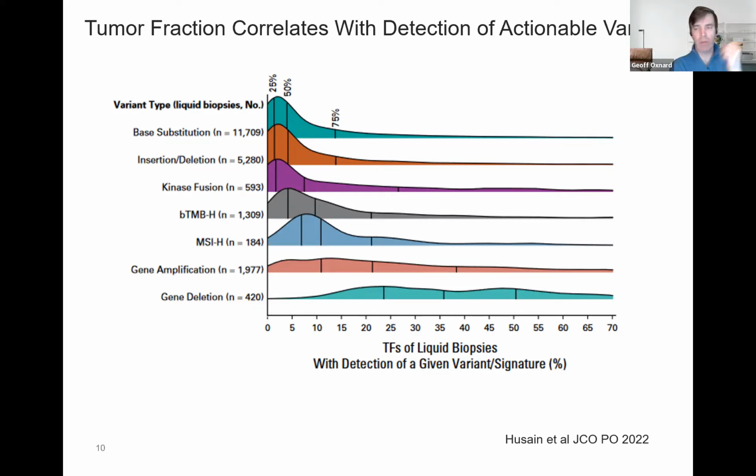This goes back to work from the Broad years back across cancer types, that you can measure that aneuploidy and estimate the tumor content using various measures, and that not only has adequacy implications, Hatim, but what the Broad found is prognostic implications. So shedding isn't just about how good the blood specimen is, but shedding tells you how aggressive this cancer is, and it can give you some sense of the risk of progression if we can just estimate it.